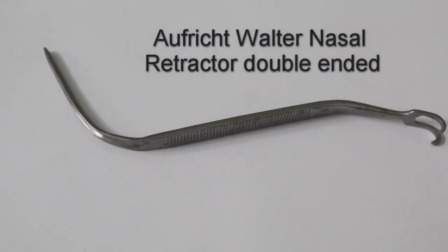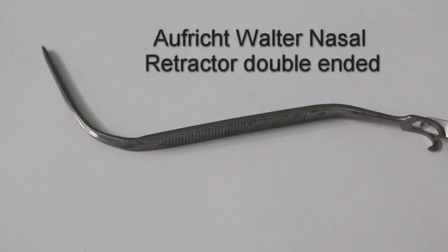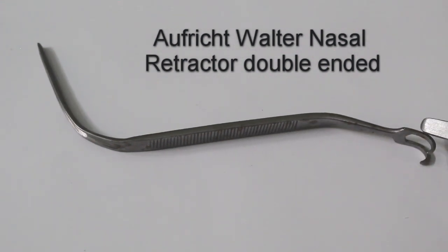This instrument is a retractor cum hook. One end is used for retracting the soft tissue, and the other end is a hook for hooking — especially the lower lateral cartilage skin.